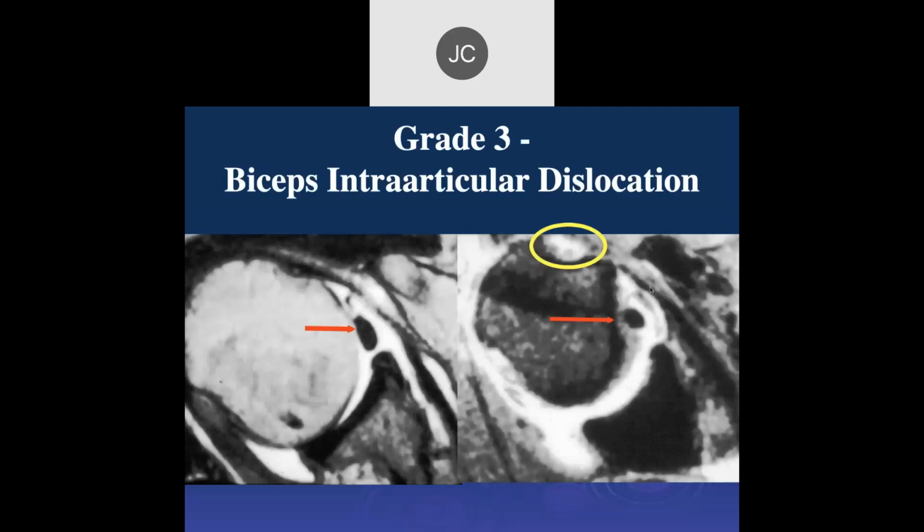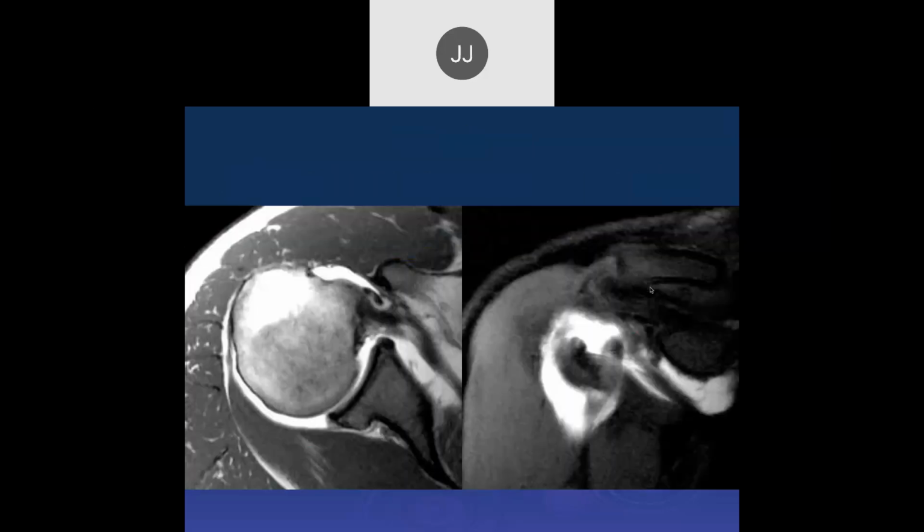So it sneaks underneath it. It sticks underneath just through the deep fibers, right? Yeah, right. It took us about a year to figure that out. Yeah. Got it. Okay.